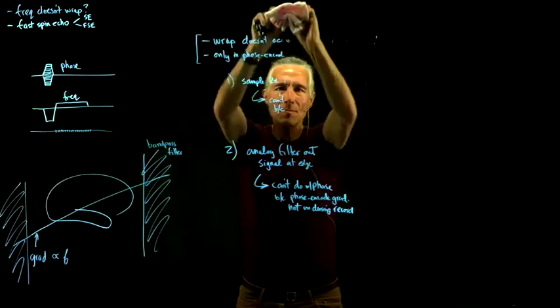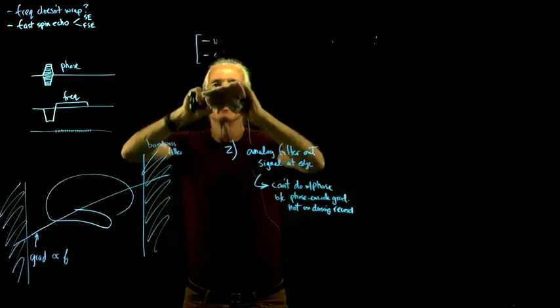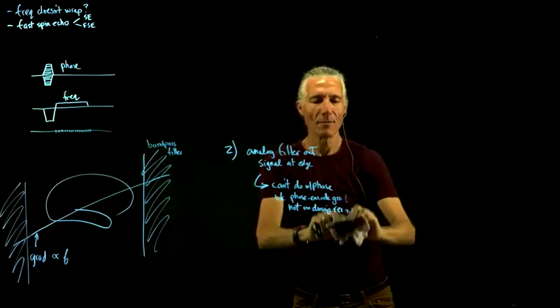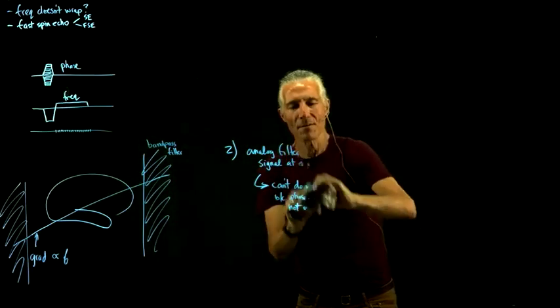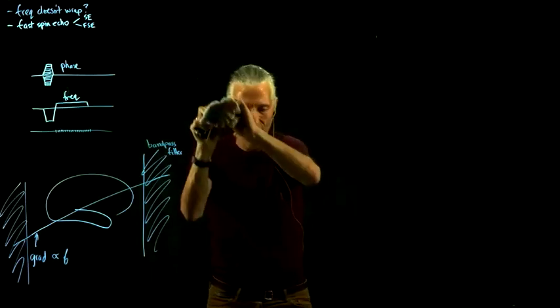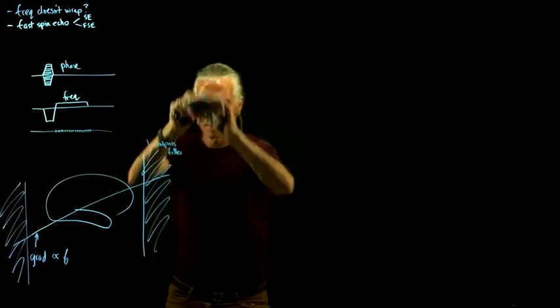And so then you would want to make the frequency encode direction the one if you had a problem with your field of view not being big enough for what you were taking an image of. Okay.